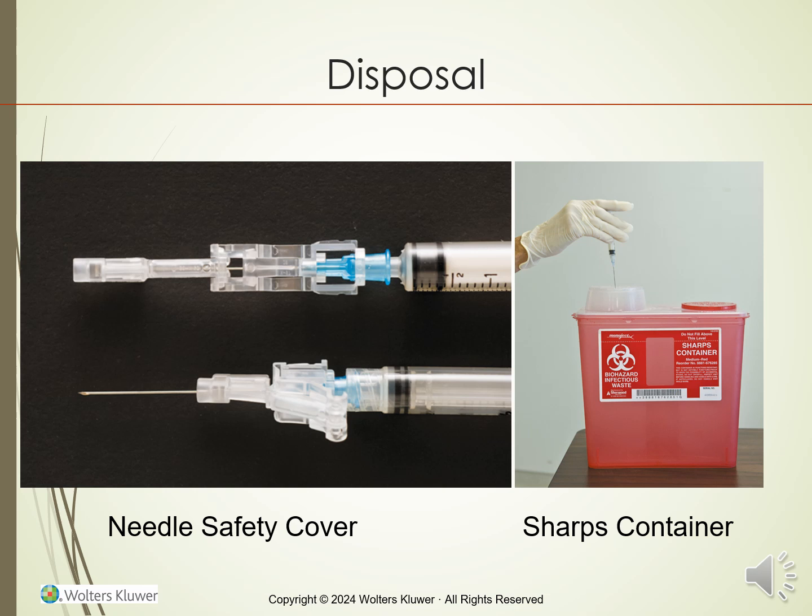Needles often have a safety cover as well, as shown on this image. Once the needle is used, you will put the safety over the top to avoid accidental needle sticks.